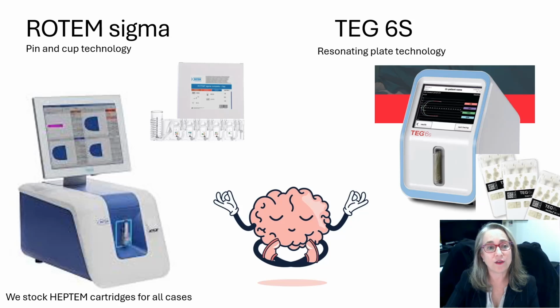Now, you'll see the little cartridge there with 5 cups in it. 4 of them are a test and 1 is a control on the left-hand side. We'll use HEPTEM cartridges for all our cases.